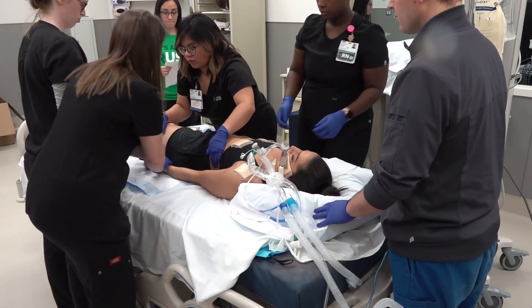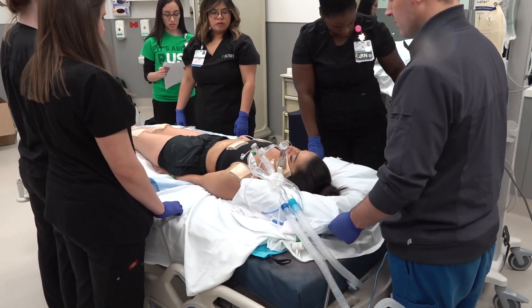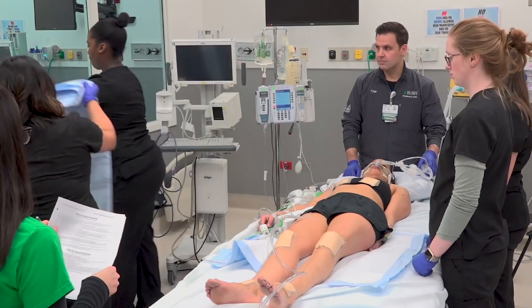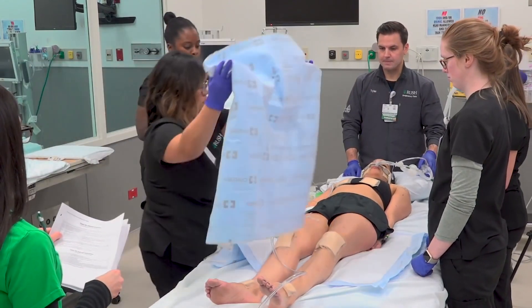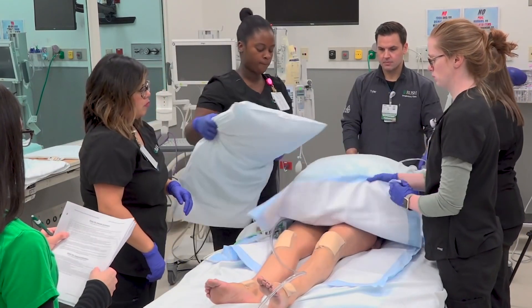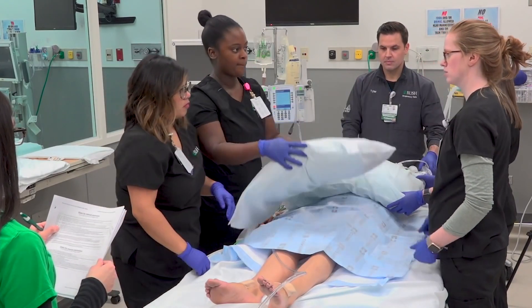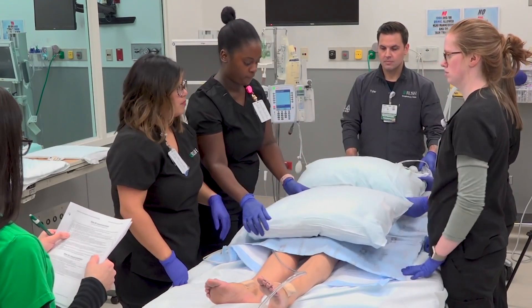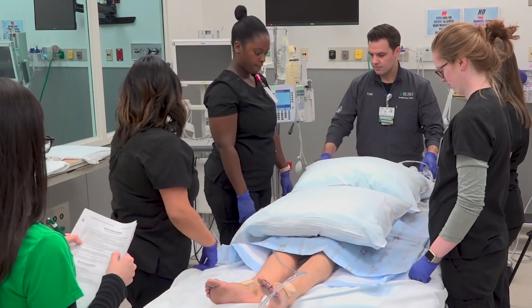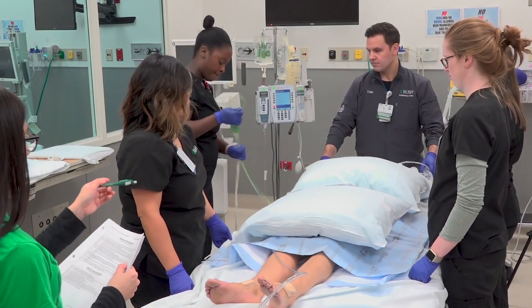We will tuck the patient's hand closest to the ventilator under the patient's buttock with the palm facing up. We will place an underpad on top of the patient's chest and pelvis. Standard pillows will be placed on top of the patient in the horizontal position — one on the patient's chest, one on the pelvis, and one on the knees. The one on the knees is especially important to help prevent pressure sores.